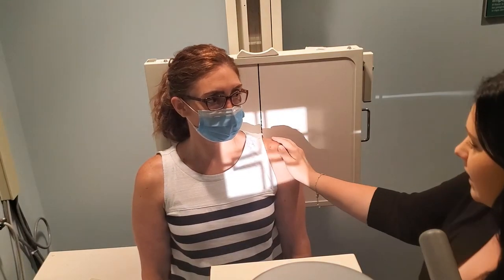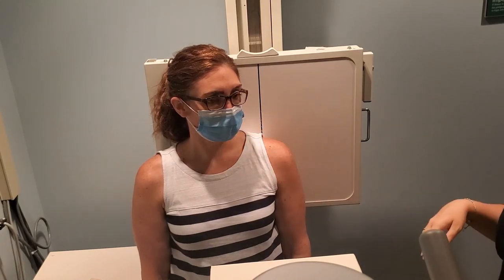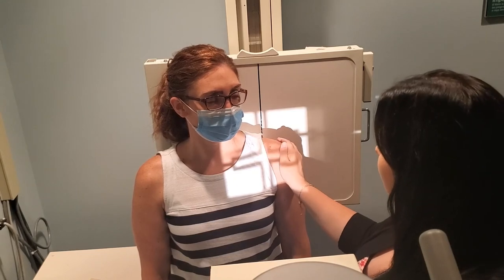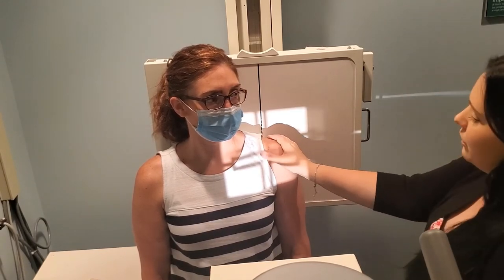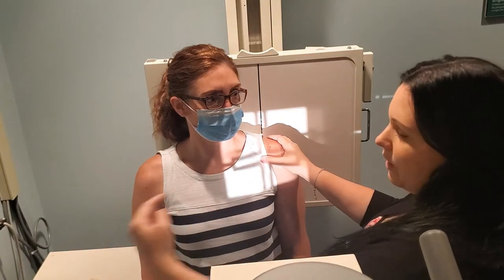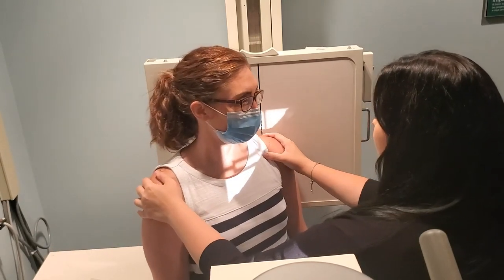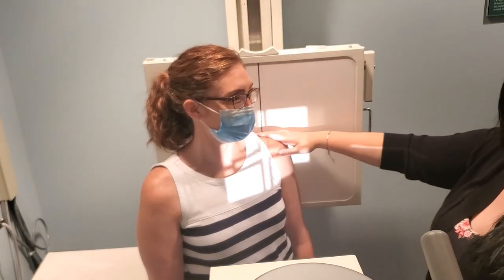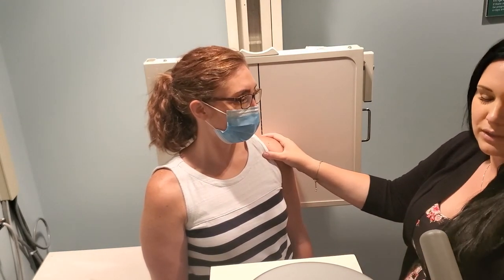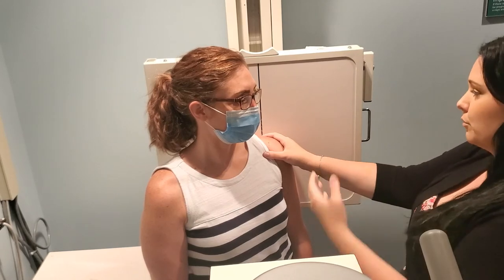The glenohumeral joint is just on the inside of that humeral head. Your rotation for this image is 35 to 45 degrees, and it can be kind of hard to figure out exactly how to rotate that. The trick I have is to put your hand on the outside of the patient's shoulder and just let your thumb drop into that joint space. When your thumb drops in, look at where your nail bed is directed — that's basically sitting in that joint space. My nail bed right now is coming off at a slight angle towards the patient's opposite side. So I rotate the patient — working on the left shoulder, she'll end up in LPO position — until my nail bed is facing straight out to the collimator and tube. That's going to make the joint space open, align the CR parallel with that joint space so it can go through it, and it's also perpendicular to the IR.